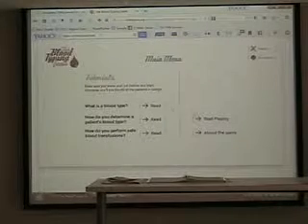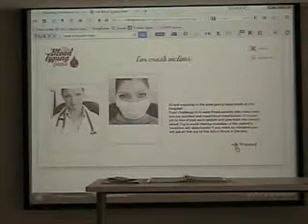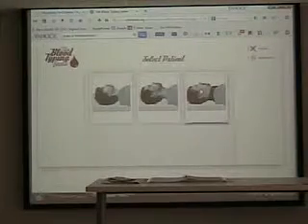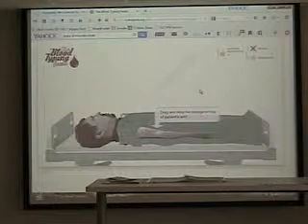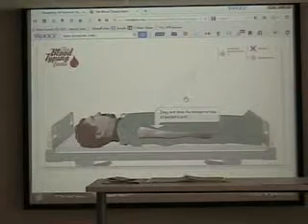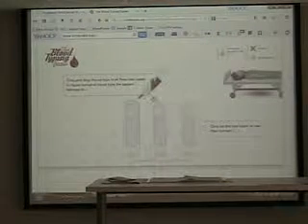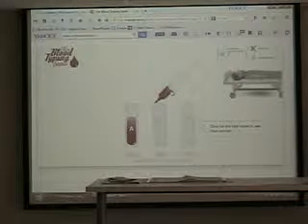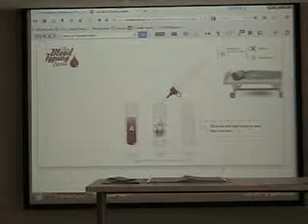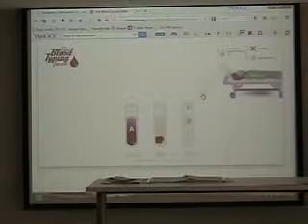So let us, when you play the game, then you click on proceed, left click, select the patient, eeny, meeny, miny, mo, I like that guy, and then we'll go to blood type. So drag and drop the syringe on the patient's arm. So I got to go get some blood, and I got the blood. Then I got to put the blood in each of the tubes. And then of course, shake it, shake it. And you shake it.